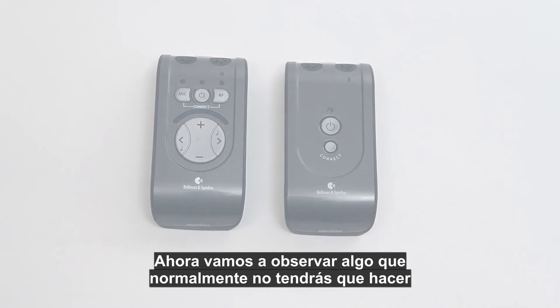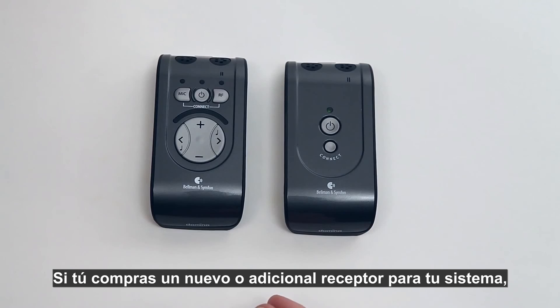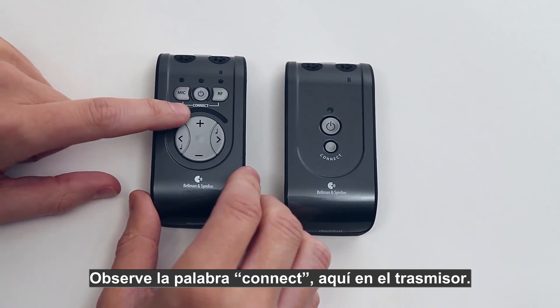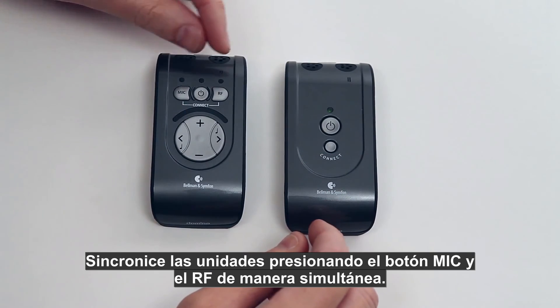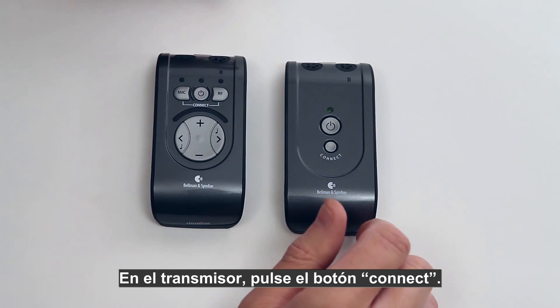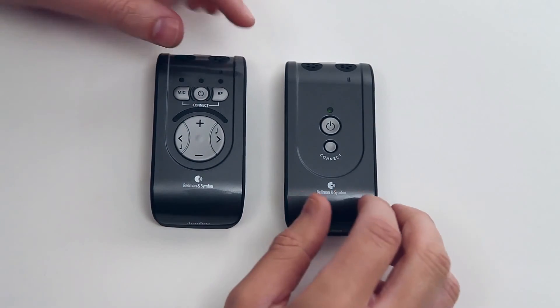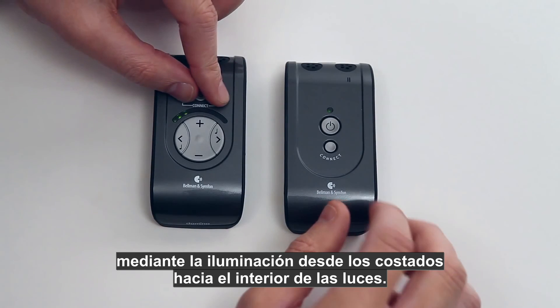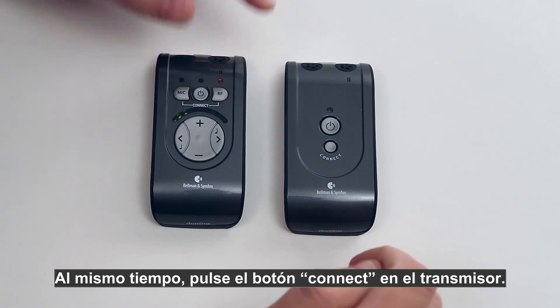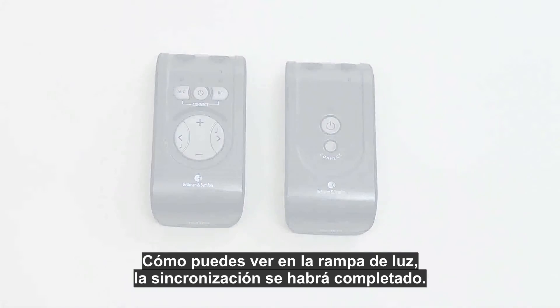Now let's look at something you normally don't have to do: pairing the units together. If you buy a new or additional receiver, you need to pair it with a transmitter. Note the word 'connect' on the transmitter unit. Pair the units by pressing the mic button and the RF button simultaneously on the receiver, then press the connect button on the transmitter. The LED light ramp on the receiver indicates that pairing has been completed by lighting up from the sides inward to the middle.